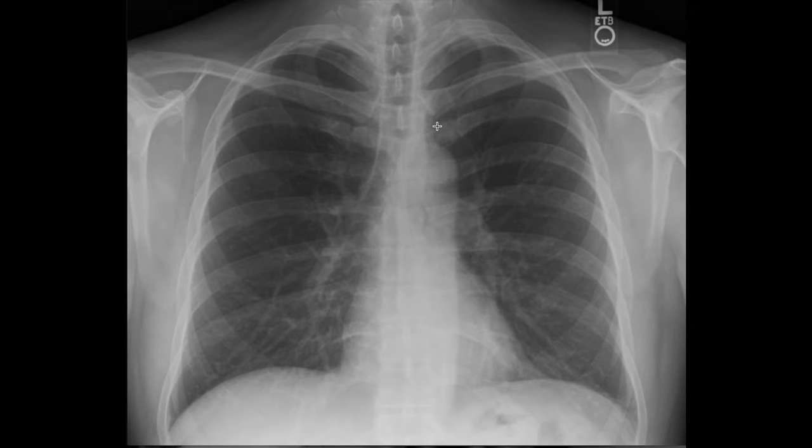What does this region include? It includes the lungs full of air. We have the left lung, we have the right lung, and it includes the mediastinal area. The mediastinal area is right here. It's the area between both lungs. It has both costophrenic angles. Costophrenic means phrenic is pertaining to the diaphragm.